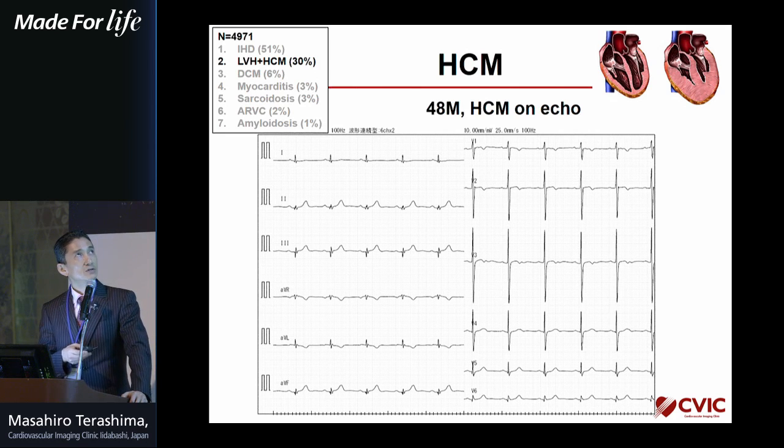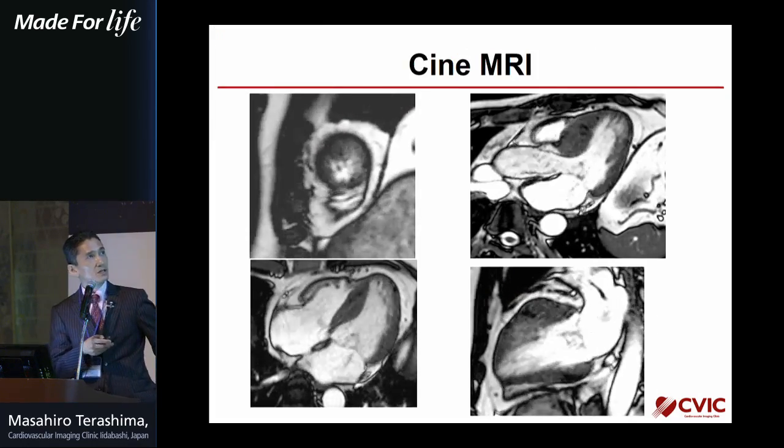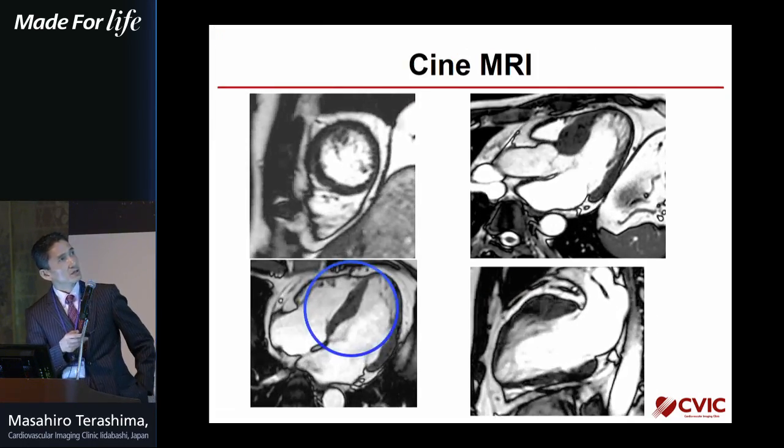So first, I'm going to start with HCM. A 48 year old gentleman, HCM was diagnosed on echocardiography. So you can see the LV wall thickening like here.